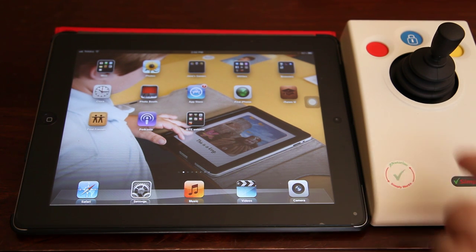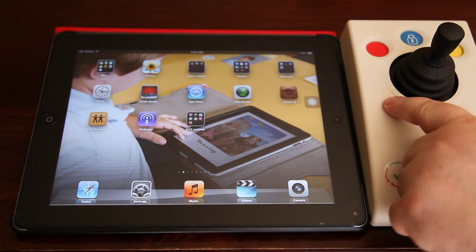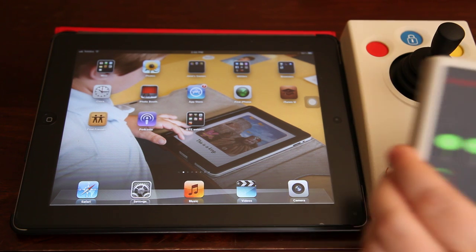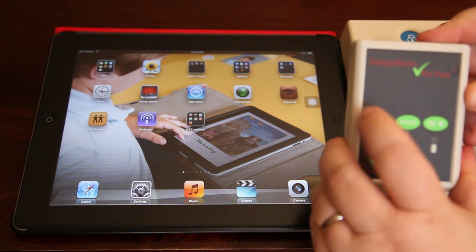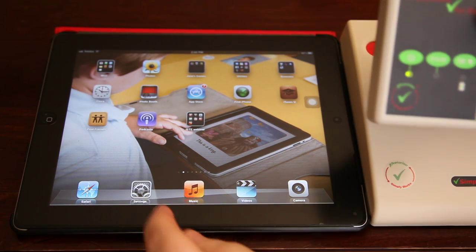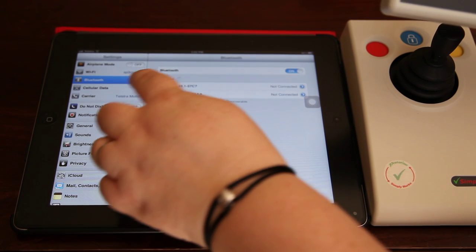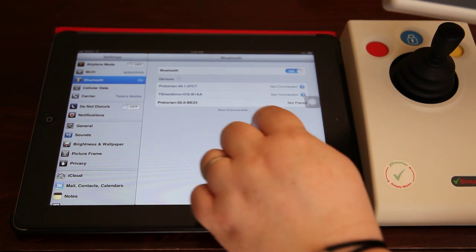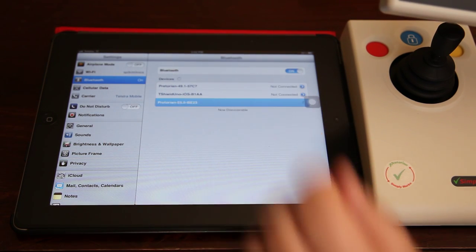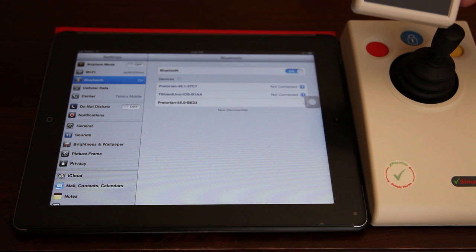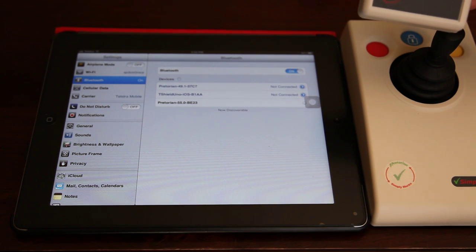I just wanted to do a short video showing you the SimpliWorks joystick working with the iPad. The first thing I need to do is turn the SimpliWorks interface on and then I need to go into my settings to Bluetooth and pair them, which I do simply by selecting it from the list of Bluetooth devices.